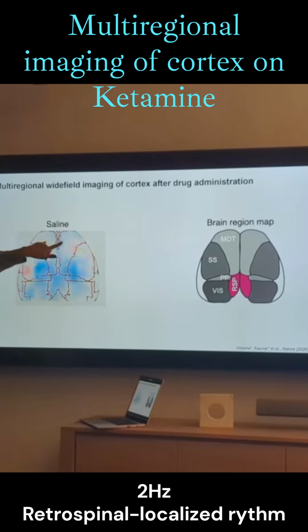You see all sorts of patterns of activity that are just sort of meandering around the brain. Sometimes you see symmetric activity up here. Sometimes you see things really light up in different parts of it. And this is the mouse brain thinking, okay? And we injected it with saline as a control, just with a salt solution.